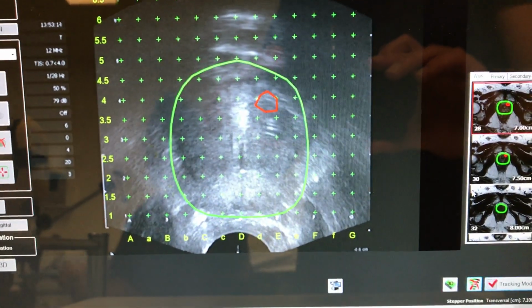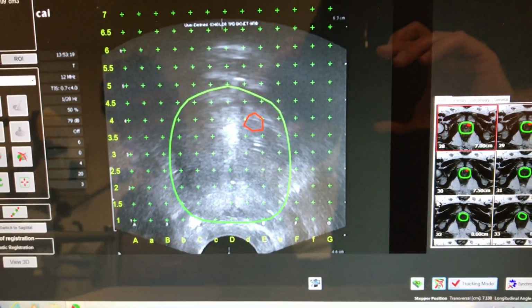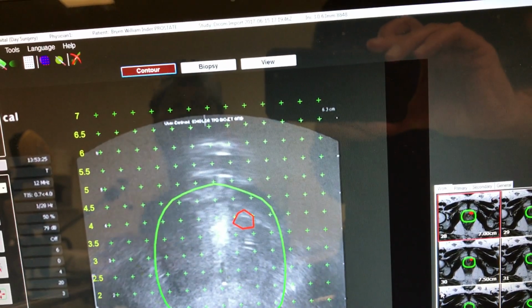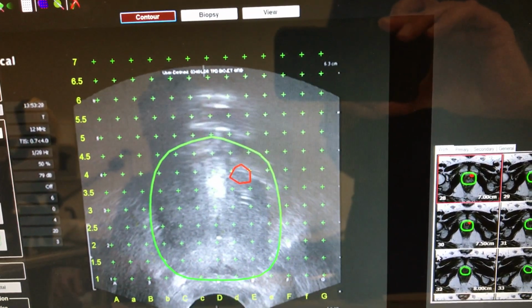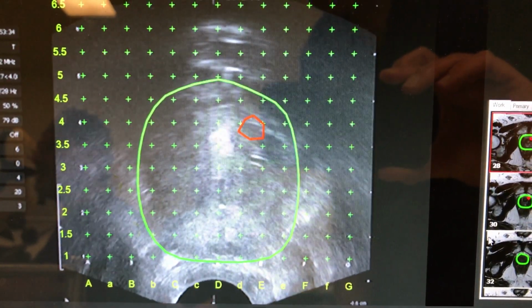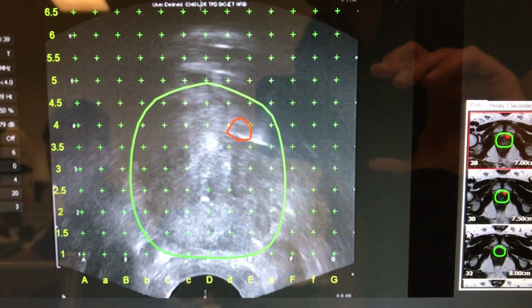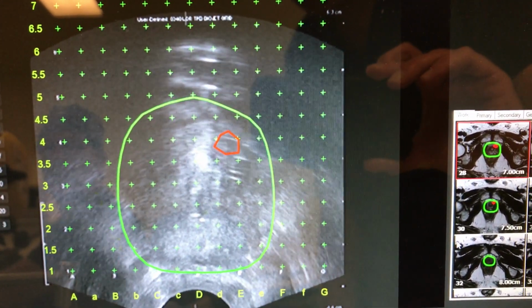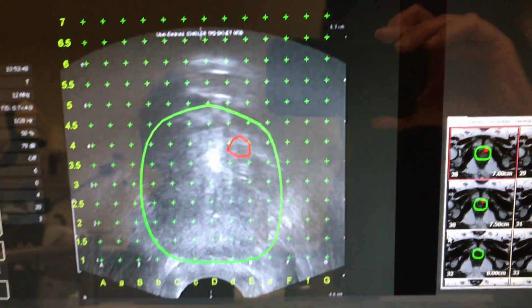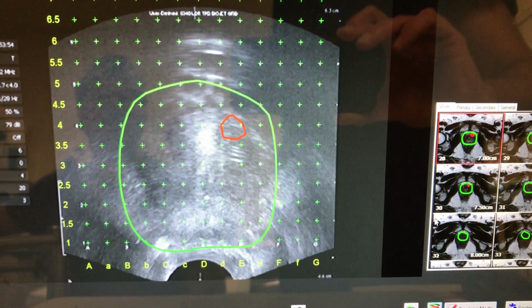So that's gone 0.5 centimetre higher. And now I'm going to go through the other area there and bevel medially, and the area and bevel down medially. And that should get the 4 samples that we need. So we're going to go into big E, 3.5. We're going to bevel the needle slightly medially. So we'll just wait till we can see it, just there. Come back and then shoot it. And we'll do exactly the same in the last one. Now I'd love to get a shot right down the guts of it.